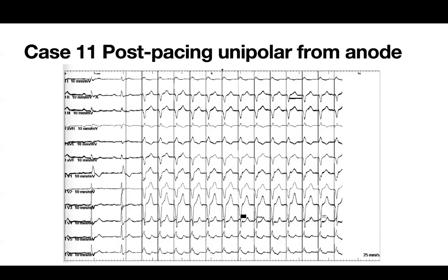Go next. So for example, here when the case was done and he was at final position, he was going to stop just to test if the anode is in or not, doing the ring pacing unipolar. Essentially the morphology that you get is the initial morphology that you were starting with to go in. I find it useful to know if the anode is in or not. I wasn't doing that at the beginning. We were using a bit of contrast injection, but nowadays, instead of injecting contrast, I just do one test in the ring unipolar, and at the end I document if the ring is in or not, based on whether it's capturing.